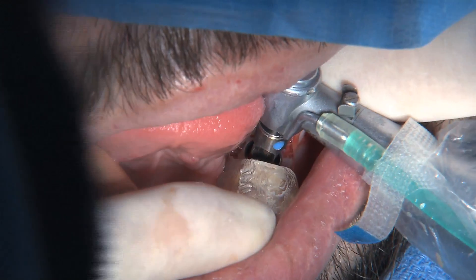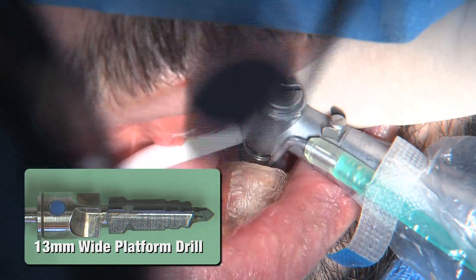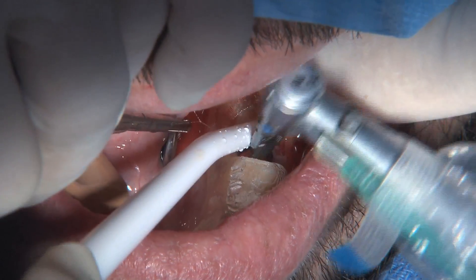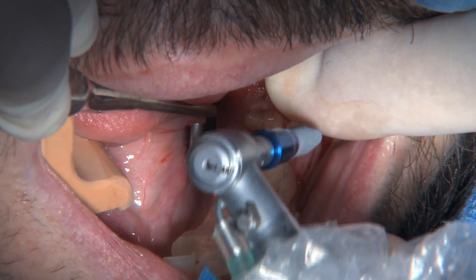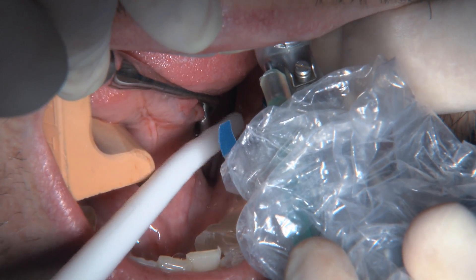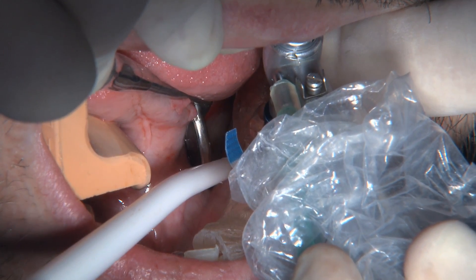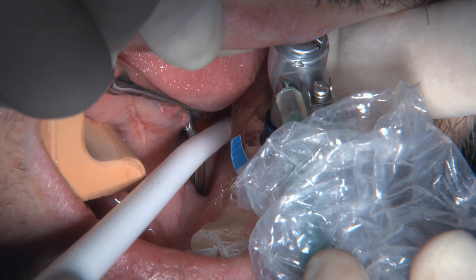This is pretty much real time — it's only taking 10 to 15 seconds for these drills to go to their full depth. I have all the confidence in the world that it's going in the right direction and right place because of the surgical guide. Now it's time to place the implant — no guides needed inside the surgical guide for the final size drill and the implant itself. You can see the implant spinning and how slowly it's going in, with the speed turned down on the handpiece, just letting the implant thread its way into the osteotomy.